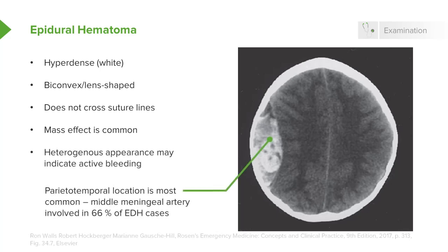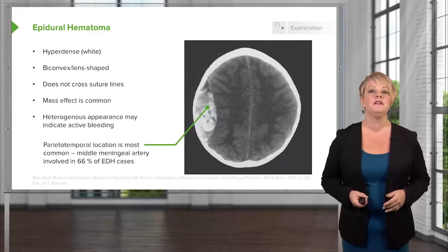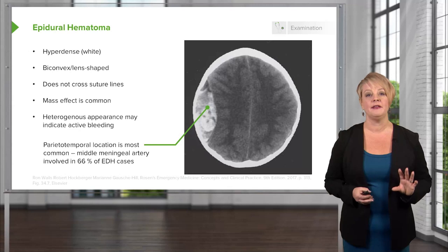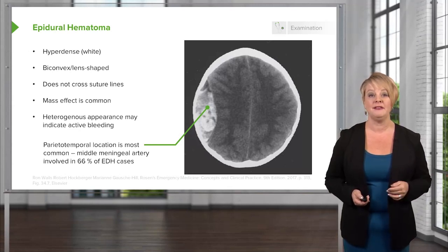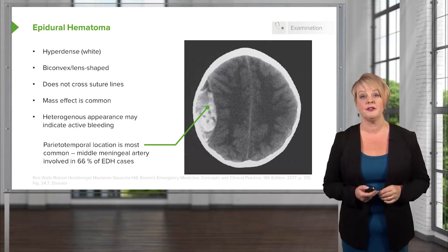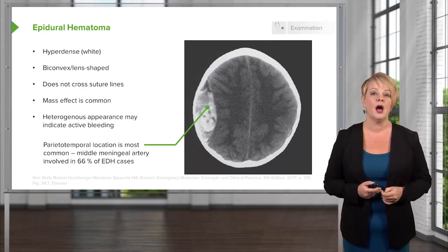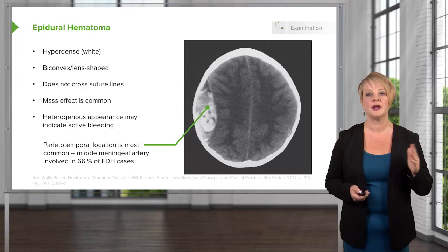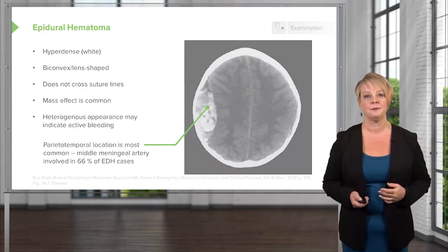It has a heterogeneous appearance, which suggests that there's blood of different ages in there. In the case of epidural hematoma, that can suggest active bleeding that is ongoing right now. This particular hematoma is in the parietotemporal region, which is the most common place we see epidural hematomas, most commonly associated with injuries to the middle meningeal artery — about two-thirds of cases occur in this region.